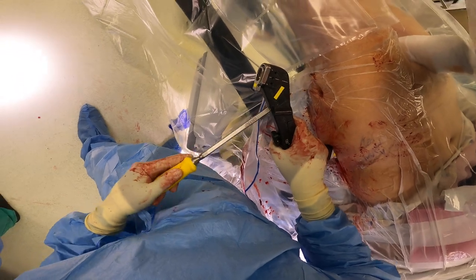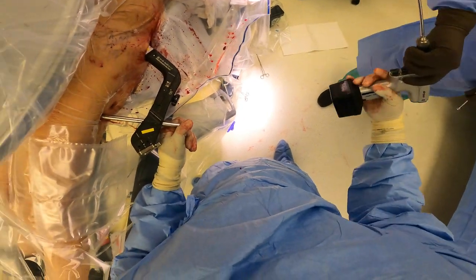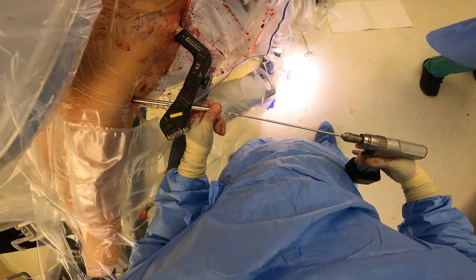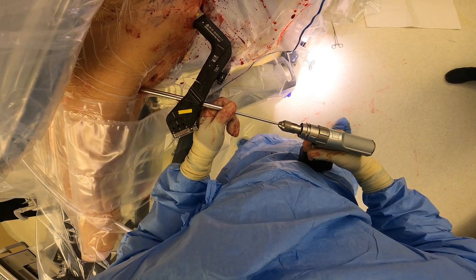I have to make a separate incision here. We're going to drill to create a path for that screw. This is a drill bit, and then we're going to place the screw inside of the bone that goes across the nail.